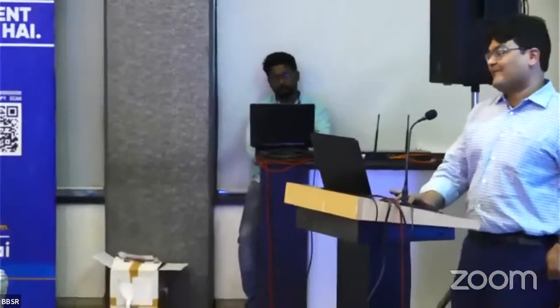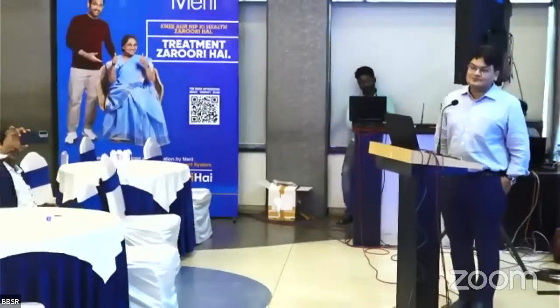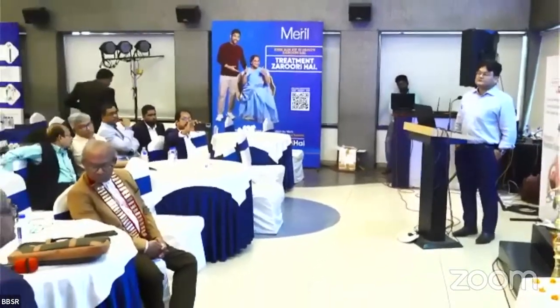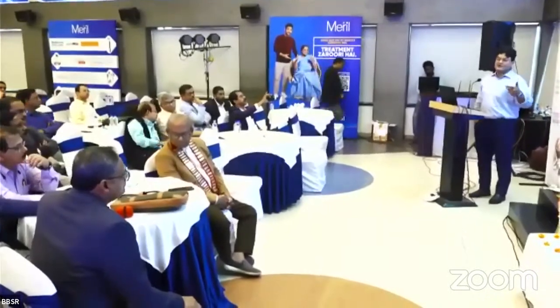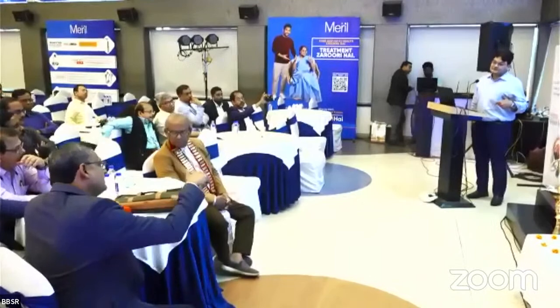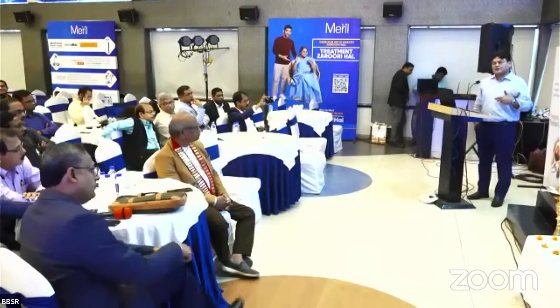Any questions? The only extra thing that you require is that you have to put in pins. Is there any complication involved in it? Because sometimes you can create a fracture. So those theoretical possibilities are there. The present system uses 2 pins in the femur and 2 pins in the tibia. Do you keep the pins inside the operating site, or do you keep them apart, away from it? No, away from the incision.